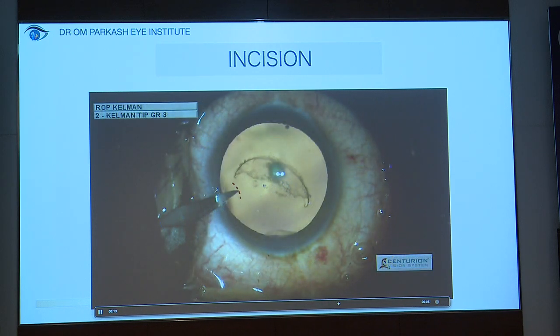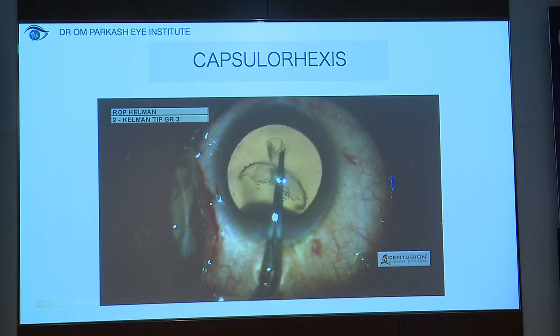The second most important part is the side port one. Because we need stable chamber settings, by all means we do not want an undue efflux of fluid from the side port. So side port incision, the stepchild should also be taken care of. So side port calibration and site of incision relative to the axis of the posterior capsular tear is also very important.